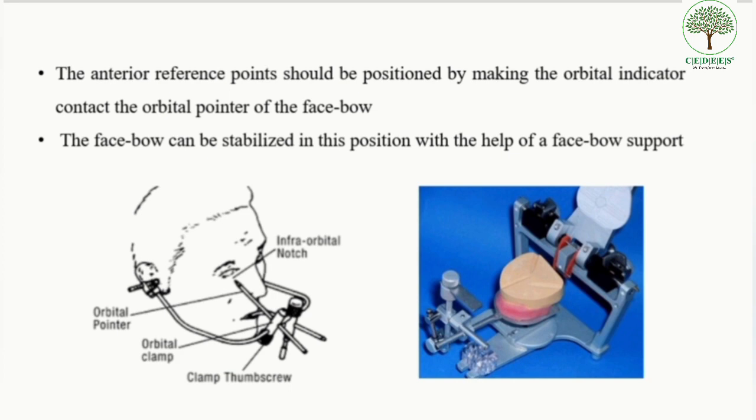After attaching the posterior reference points, the anterior reference point is positioned by making the orbital indicator — attached to the upper member of the articulator — contact the orbital pointer of the face bow. Once the face bow support is attached, the upper member of the articulator is opened completely, as shown in the picture, so that it does not interfere with the placement of the cast.